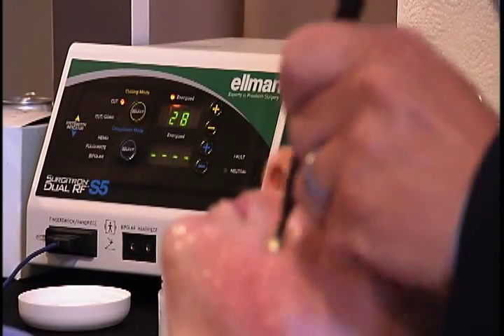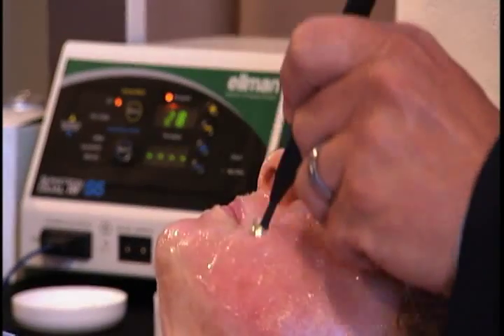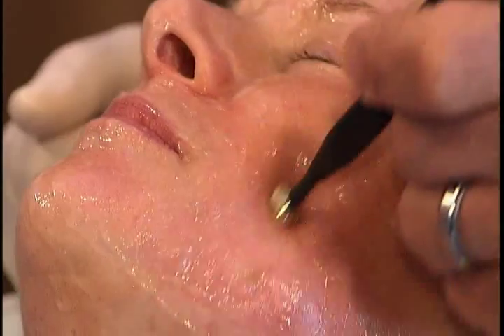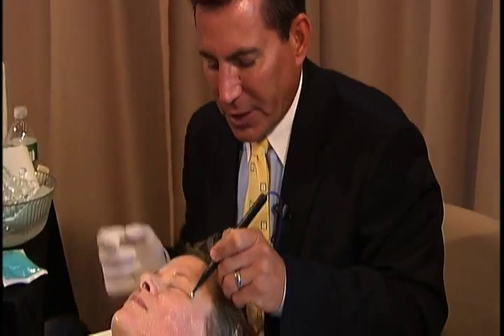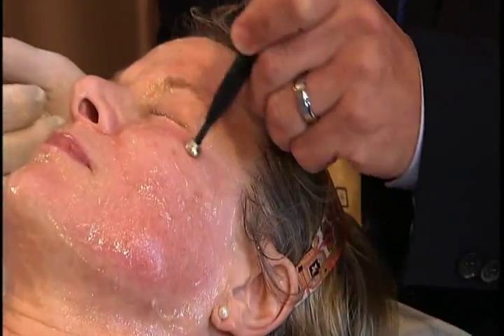It also looks like you're avoiding the vermilion part of it. That's correct. Yeah, there's no reason to avoid the vermilion. Actually, in some patients, I'll put the gel on and treat the mucosa also. It's kind of difficult to stay on the vermilion, so I kind of have them hold their lip, and I actually might put a little 2x2 underneath there at that point because it's really easy to slide off. Haven't taken any crowns off yet, but you can get a little bit of smoothing in the mucosa as well.